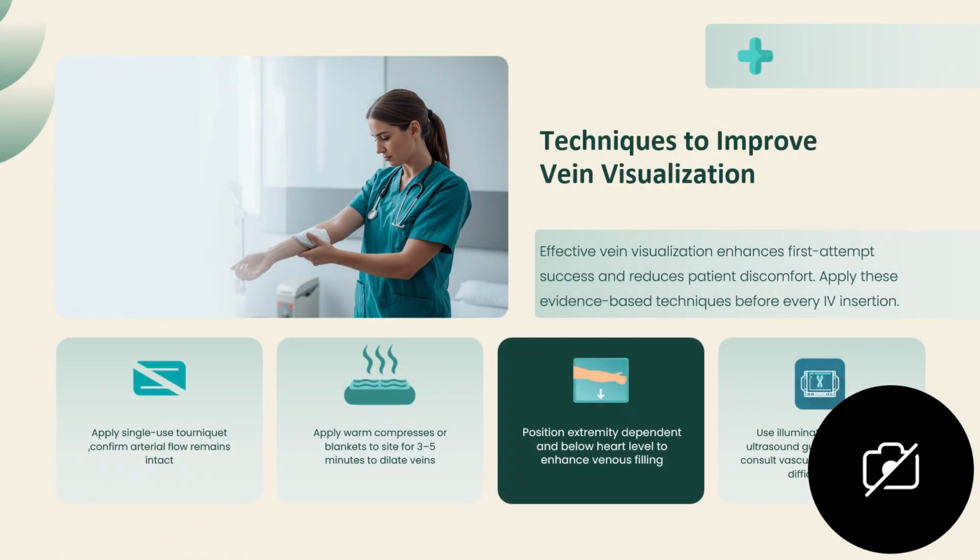Okay. We have techniques to improve vein visualization. Effective vein visualization will enhance first-attempt success and reduce patient discomfort. You can apply any of these evidence-based techniques before every IV insertion. So first, as usual, you use a tourniquet. The most important thing when using a single tourniquet is to confirm the arterial flow remains intact.